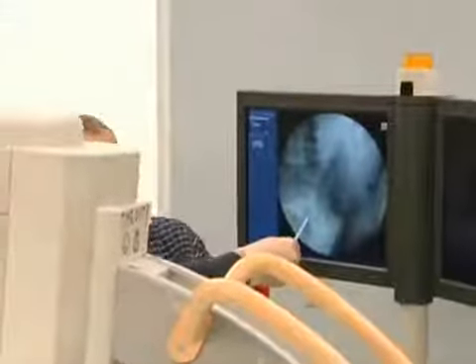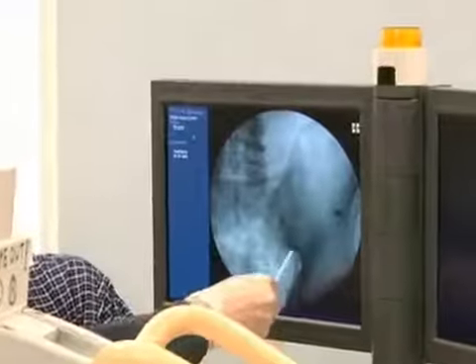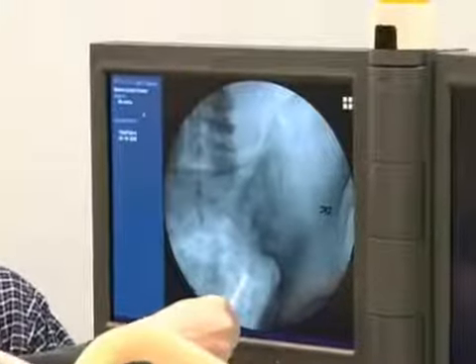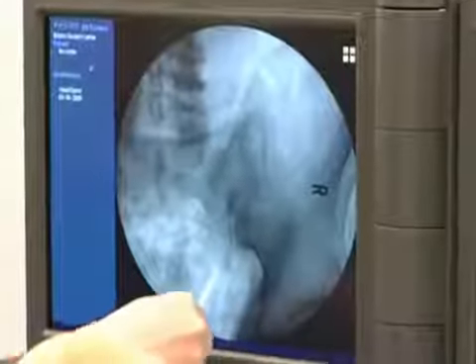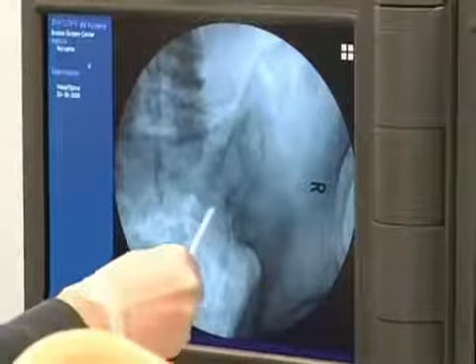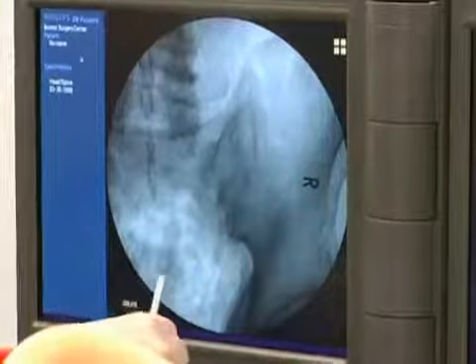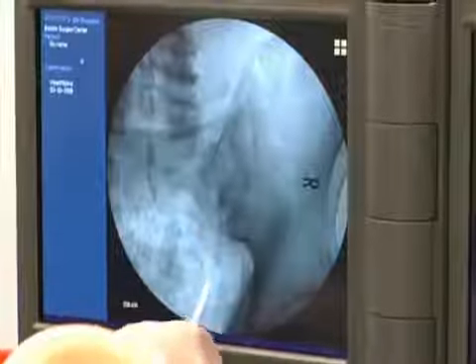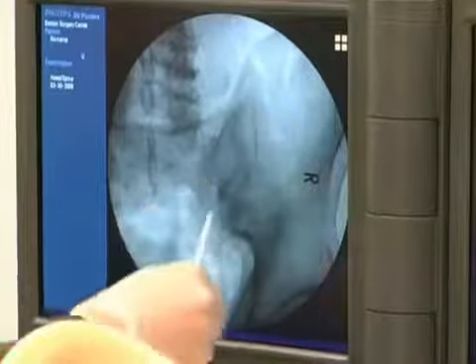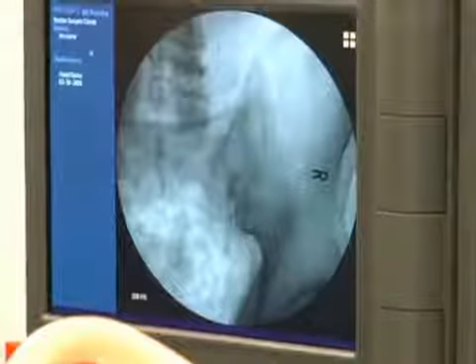If you look down, it's usually across from S4. So if this is 1, 2, 3, 4, it's amazing we can actually see it. You can see where the sacrum's coming up here. So I'm going to touch bone right here. I'm going to start a little bit lower, touch bone here, and then start wiggling along. Here's my sacral line, or the foraminal line. Remember, I don't have to see the dorsal foramen with this. I just have to know where they are. Then I wiggle along underneath the ilium, following the line of the joint until I bury it in the wing of the ala. Okay?